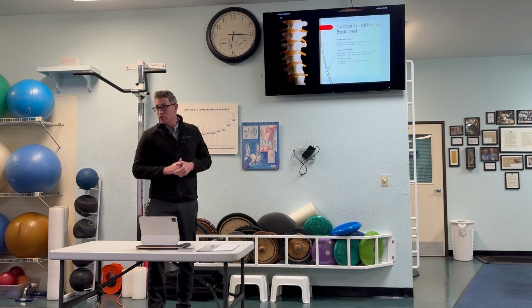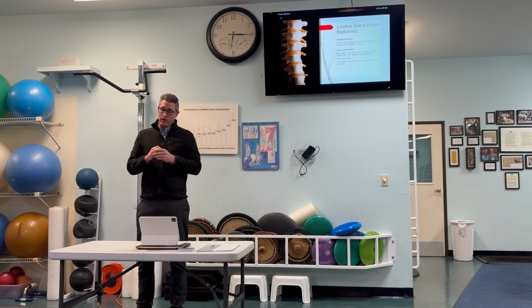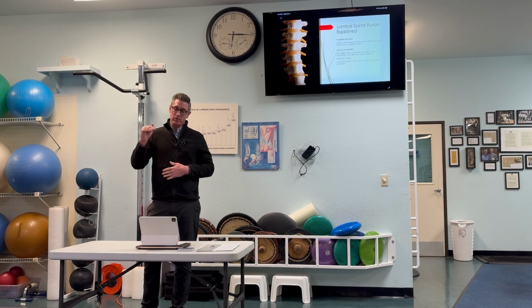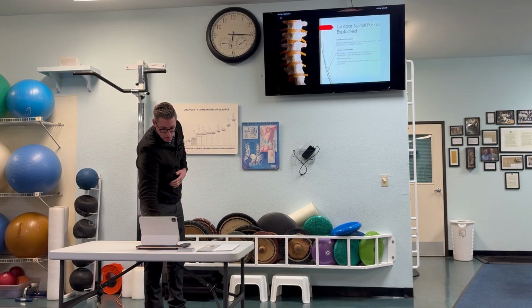So what is a spinal fusion? Essentially, spinal fusion is linking those bones together. That can again be done in a variety of ways, but linking from one segment to the other. That can be done across the disc, such as this model demonstrates here, or even in what we call the transverse processes. Essentially, our goal is to link one unit or more, depending on the number of levels that we are deciding to fuse.